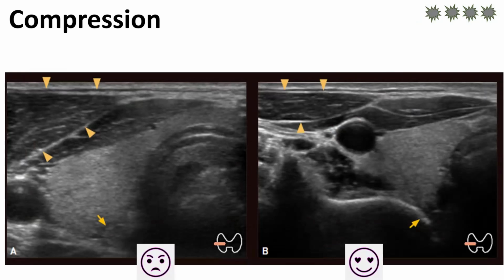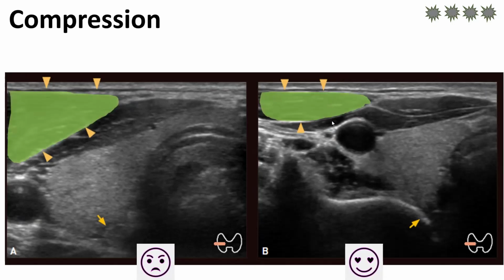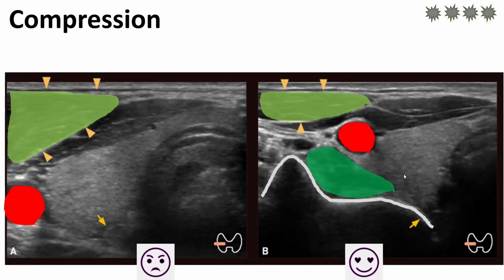These are images of the same patient under different pressure. When pressed properly, the thickness of the SCM is reduced. Therefore, the position of the common carotid artery changes as well. In the image on the right, when properly pressed, you can see the longus colli muscle and the C-spine on the back.